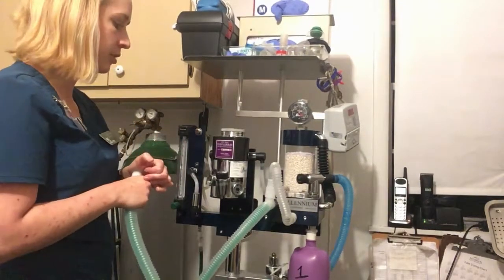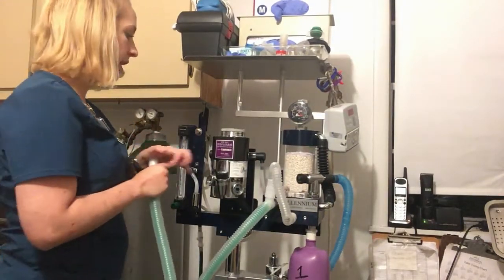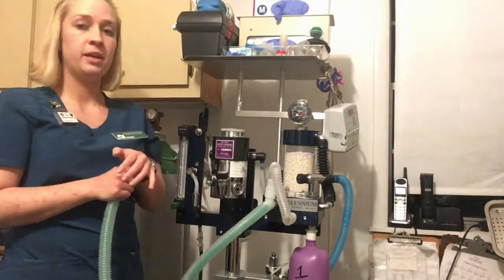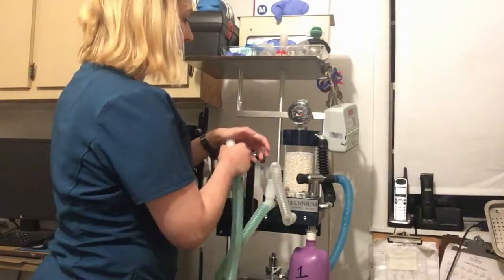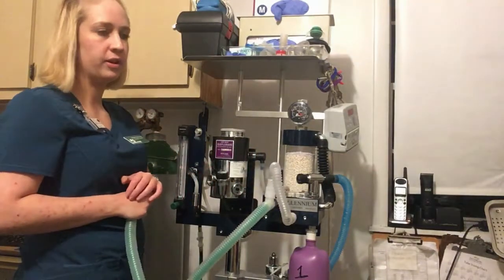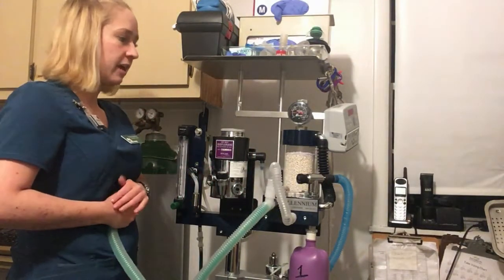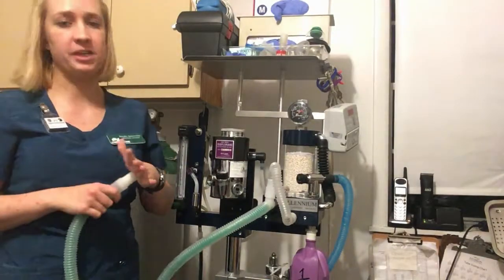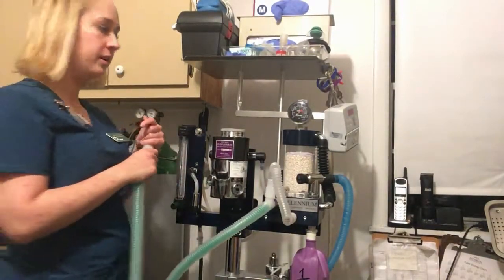This makes sure that there are no leaks whatsoever. Once you've done that, it's best to go ahead and let go of the pop-off valve. That way you can make sure that everything is flowing correctly through your scavenging system, and that you'll know that it's open for your patient and coming up in the future.